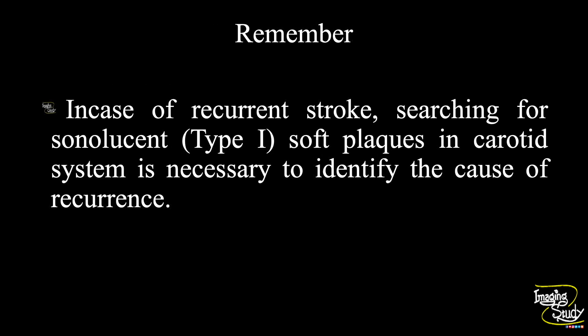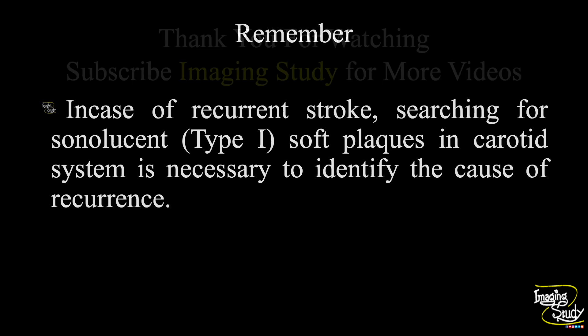The take-home message: in cases of recurrent stroke, search for sonoleucent or type 1 soft plaques in the carotid system. It is very necessary to identify the cause of recurrence, and these soft plaques are one of the most common causes. These plaques are best visualized on color Doppler.